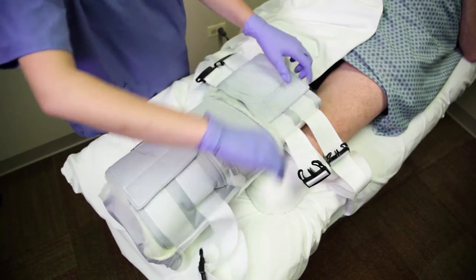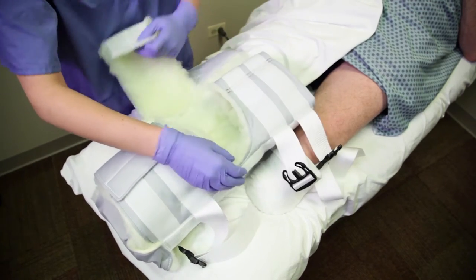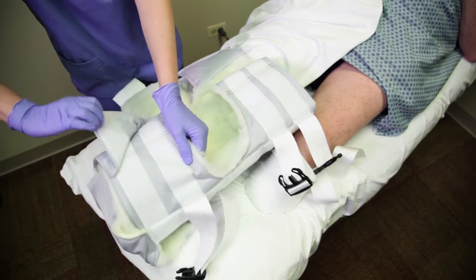To fit the Rook BKA rigid dressing to a patient, first completely open the dressing by undoing all straps and hook and loop closures.